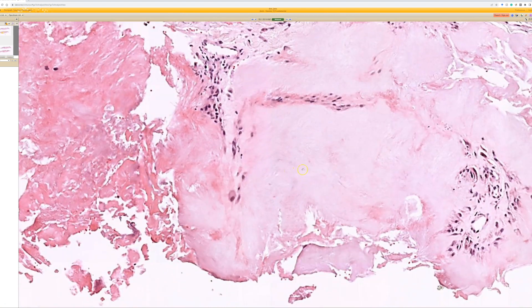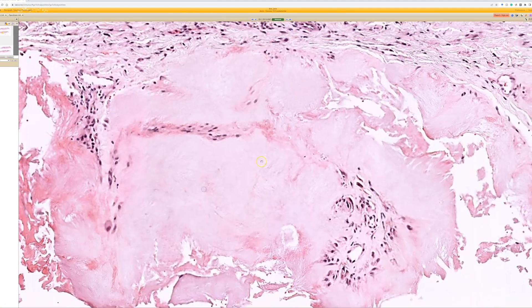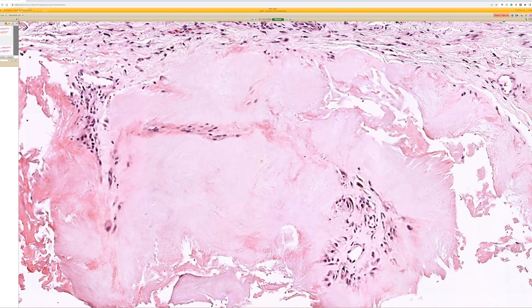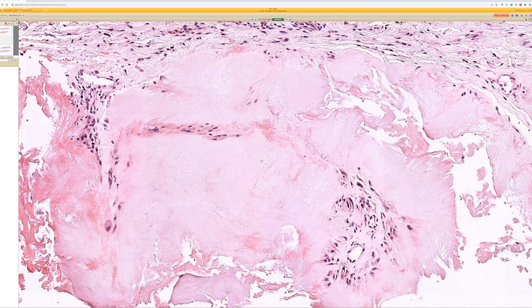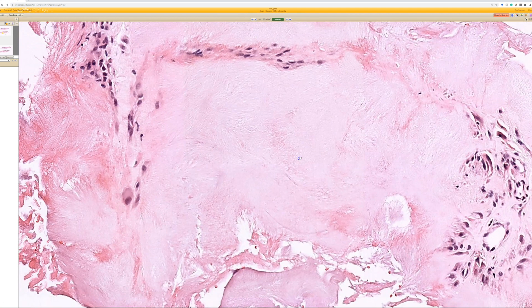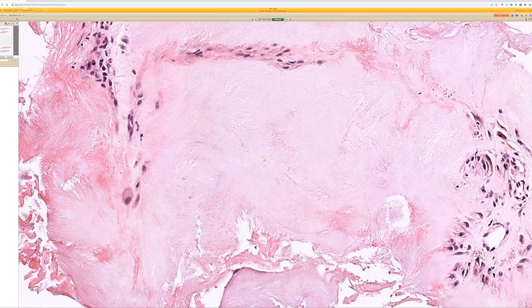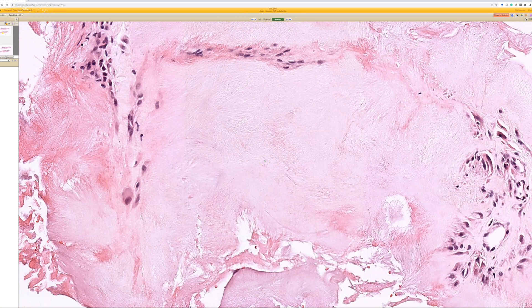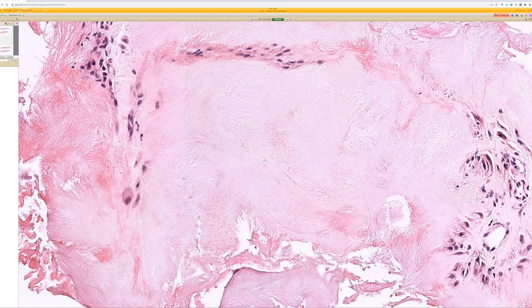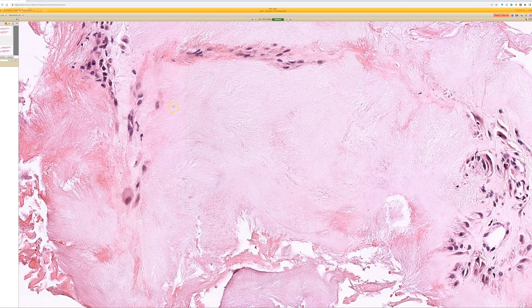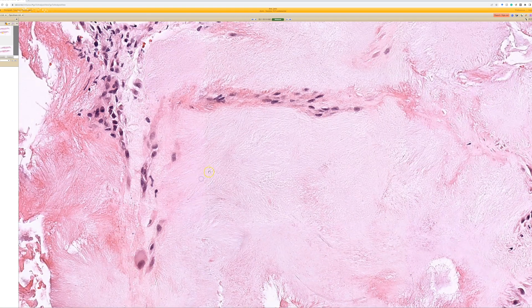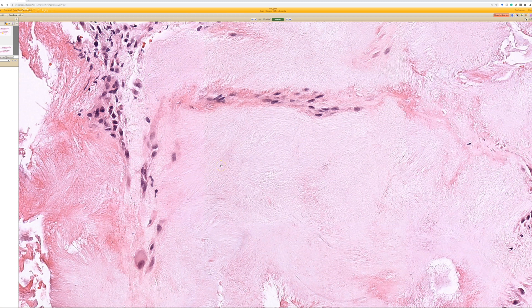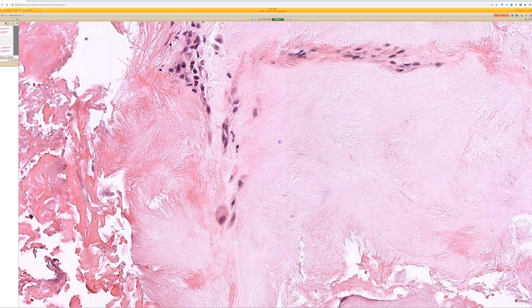When you go closer, like here it looks very amorphous and almost amyloid-like at low power, but once it comes into focus, now we can see it tends to have that kind of very thin little slits that look like little needles. But again, even though it looks needle-like, if you polarize this slide here, it'll be negative because it's all been dissolved during processing and staining.